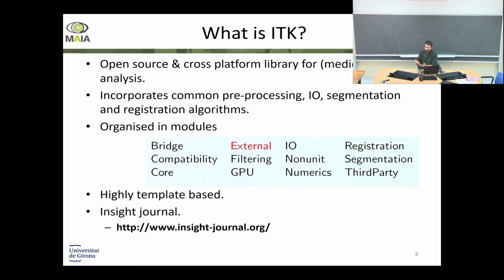One way to check the difference between two images is to do a subtraction. It's a very basic thing. But if those images are not aligned, this subtraction will highlight movement or differences that are due to misalignment. Registration is a very vast research field.